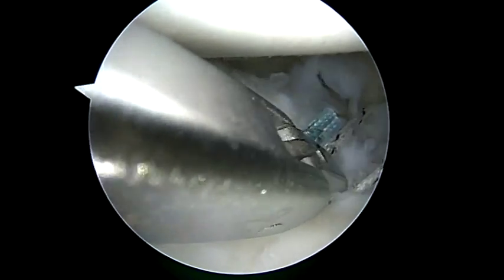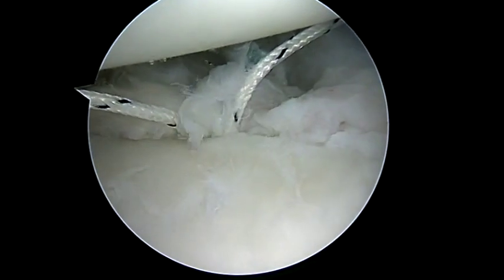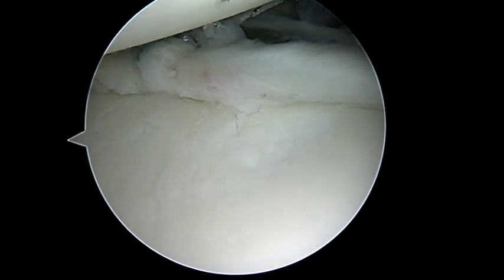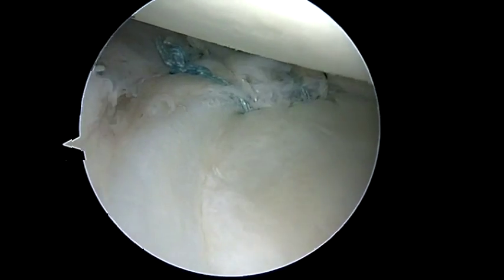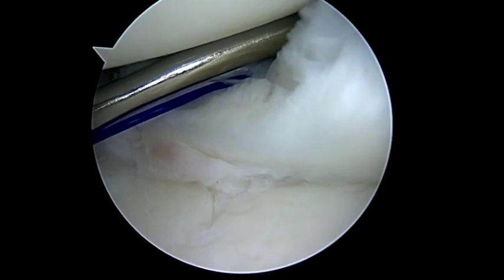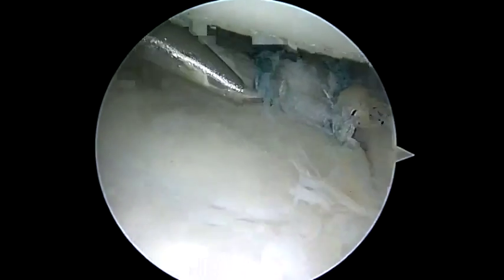The 7 o'clock portal is used for suture management, and a 45-degree left Spectrum is used through the anterior portal for suture shuttling. This 3-anchor repair anatomically restores the anterior band of the inferior glenohumeral ligament and eliminates the capsular redundancies seen on initial diagnostic arthroscopy. The transverse tear in the rotator interval capsule is repaired with a PDS suture, and the final repair construct is seen here through an anterior portal.